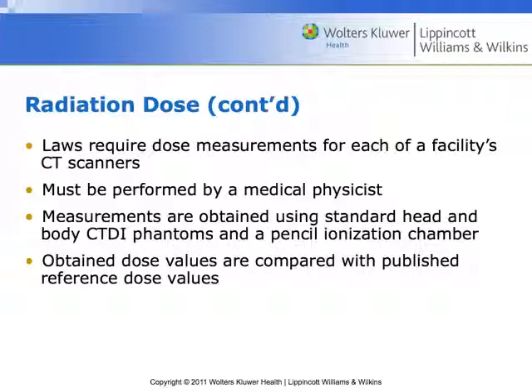Another really important part of reporting dose goes back to CTDI again, and I believe it's called DLP. There's going to be numbers that are generated by the scanner. We'll take a screenshot of those numbers and normally include those with the images in PACS because they are an accurate way to report what the patient's dose was for that scan.